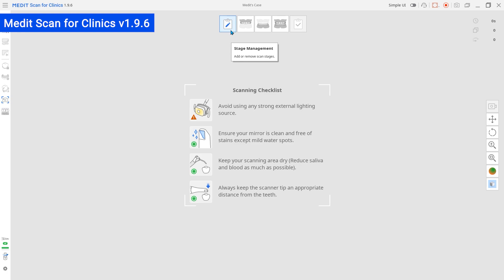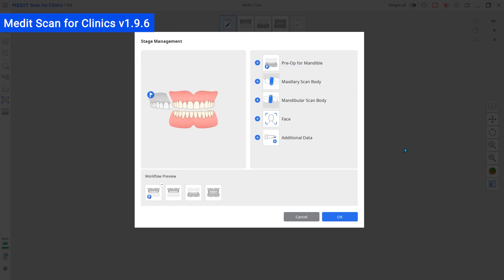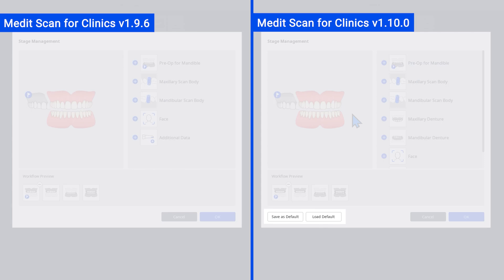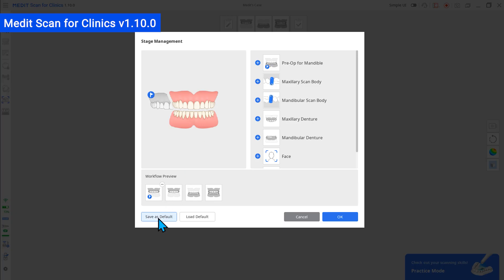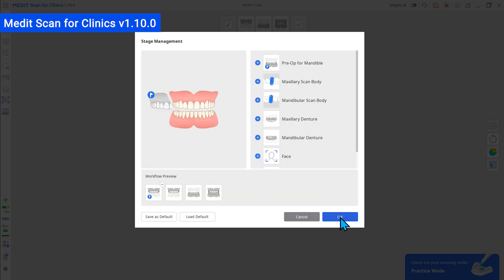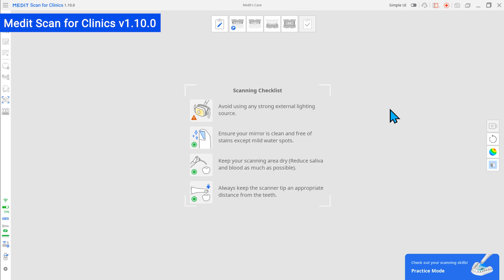And lastly, users can now save their preferred scanning workflow as default in the Stage Management dialog. You no longer need to set your workflow every time you open a new case.